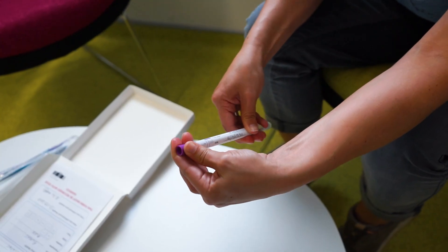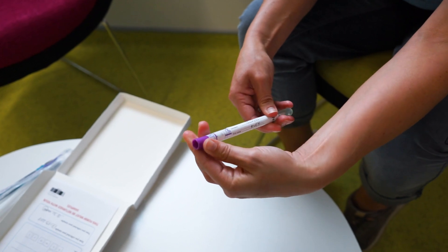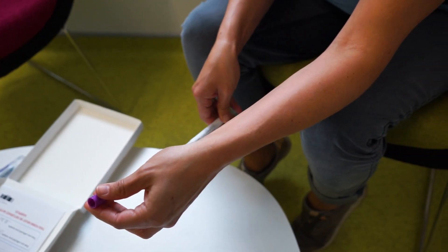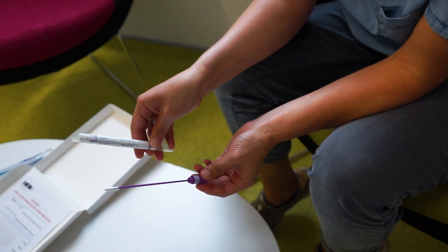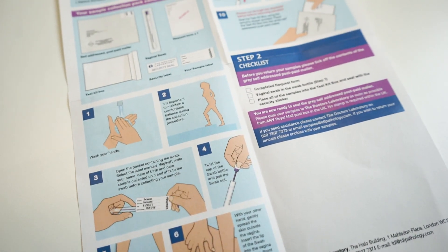Wash your hands and get into a position that you feel comfortable in. Twist the cap of the swab bottle and pull the swab out. Hold the swab by the cap with one hand so the swab tip is pointing towards you. With your other hand, gently spread the skin outside your vagina.